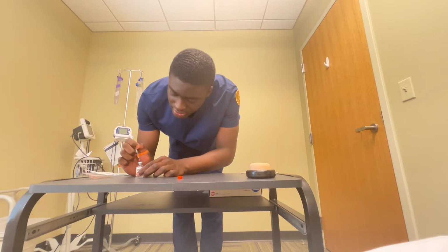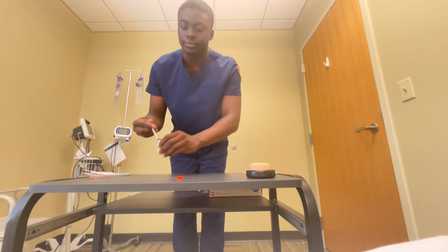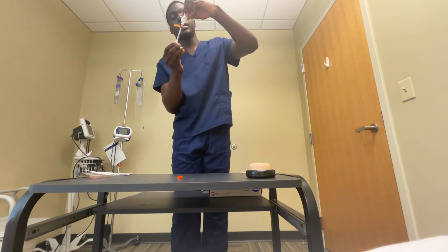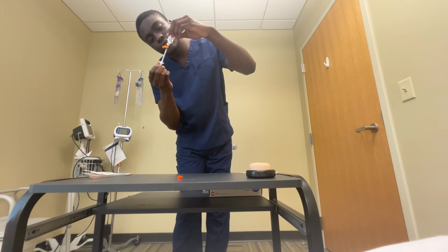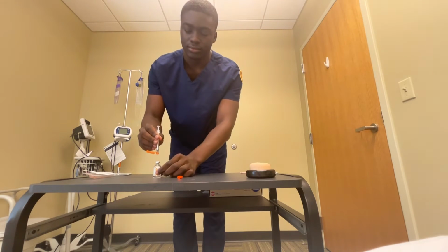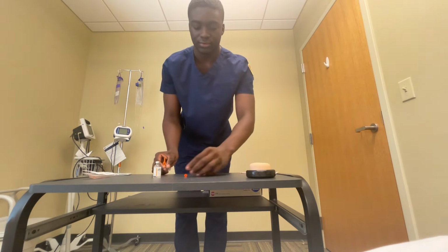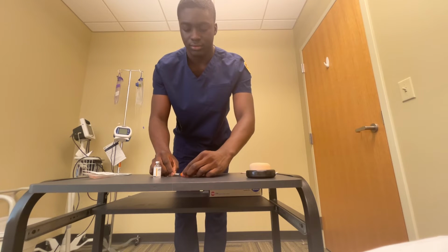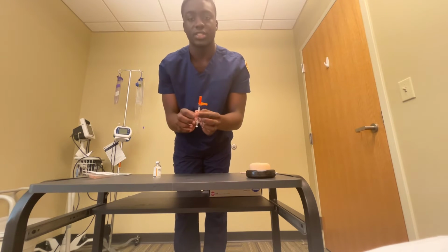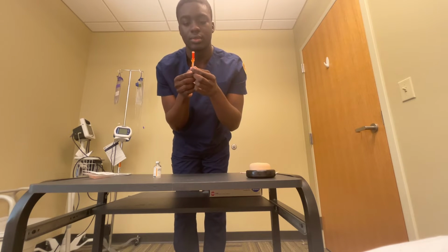And then inject the syringe into the vial. And then inject the air. Turn it upside down. Draw up 10 units. And use the scoop method. Ensuring that I don't have any air bubbles.